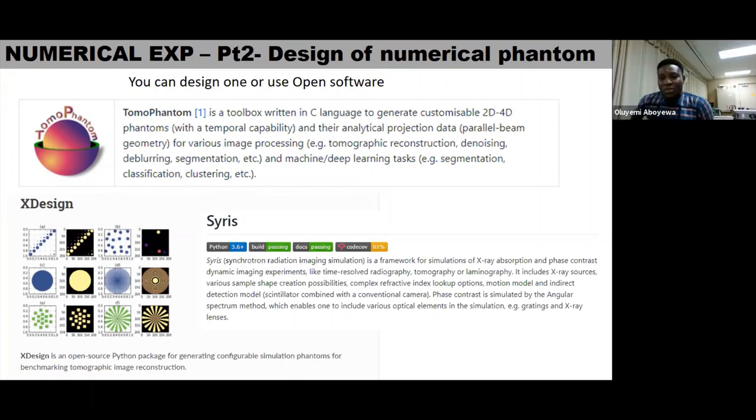Dual energy CT may still be good in the planning algorithm, because even the conversion algorithm from going from Hounsfield units to electron density needs a form of energy correction. Remember, we're working with low energy to get our image, and then we want to treat at a high energy. So there is still a form of conversion going from low energy to high energy.